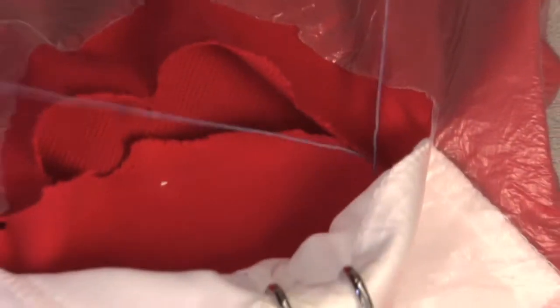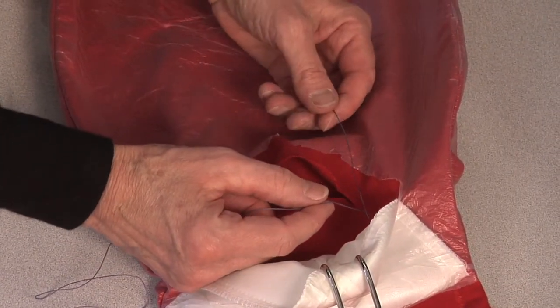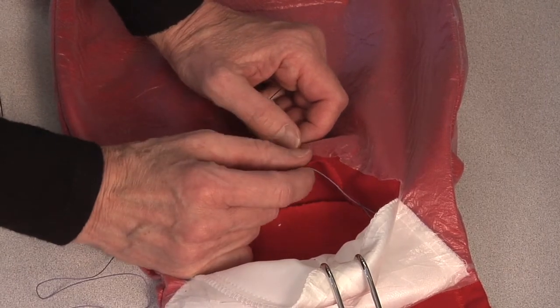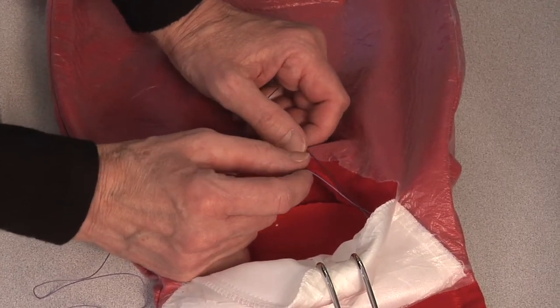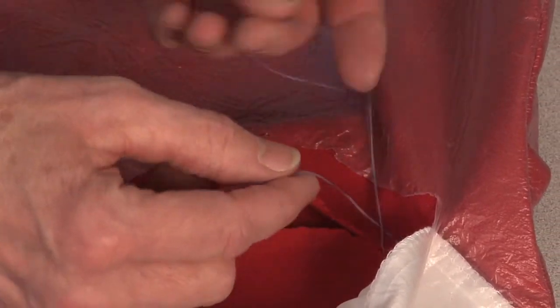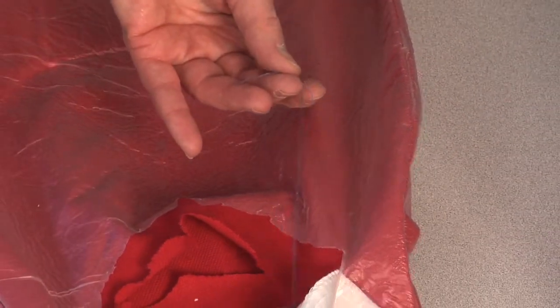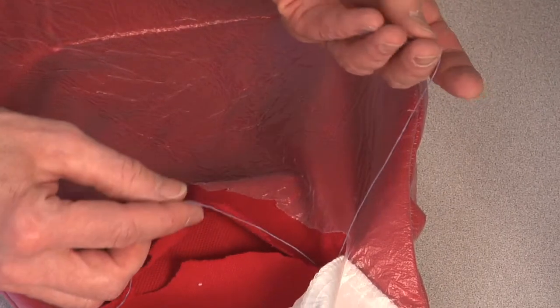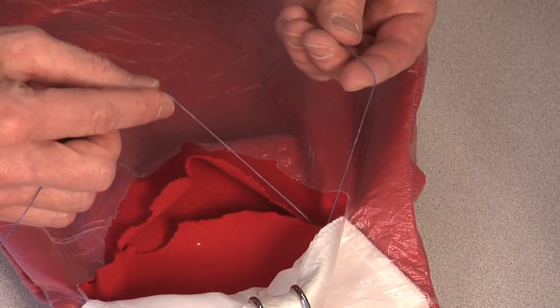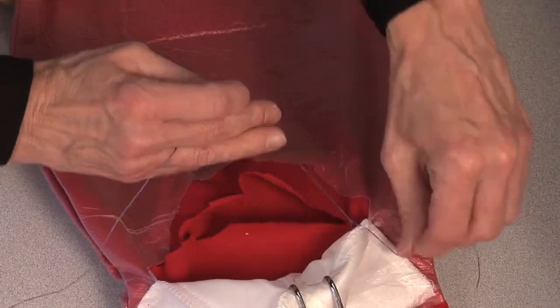Before I tie my knot — there are different knot-tying sessions we do. We practice tying knots with two hands. Anybody do Brownies or Girl Guides? You know how to tie a reef knot — that's what a surgeon's knot is, it's a reef knot. But you can't do that here because you don't have two free ends; one end is attached to the needle. So you learn how to tie a knot with one hand. I'll give you the demo.